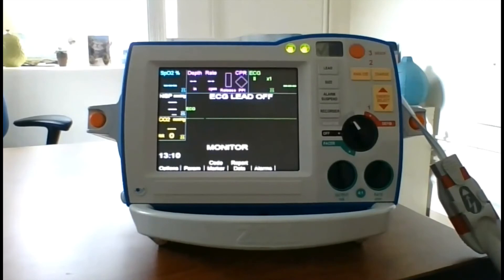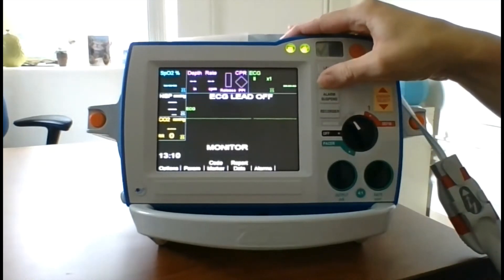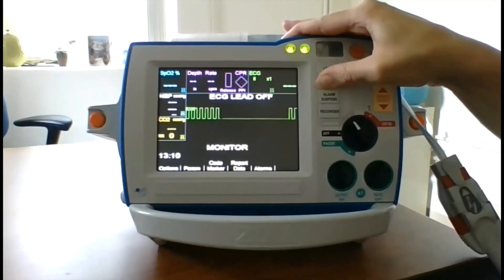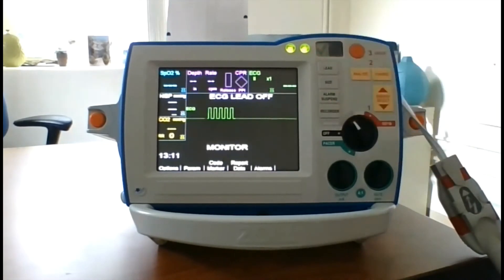Lastly, we'll perform the recorder test. Check the printer for an adequate supply of paper before you begin, then press the recorder button. Press and hold the size button for at least 2 seconds. A calibration pulse will appear on the display while the button is being held. Select the printout and inspect it for uniformity and darkness of printing. Press the recorder button to stop printing.